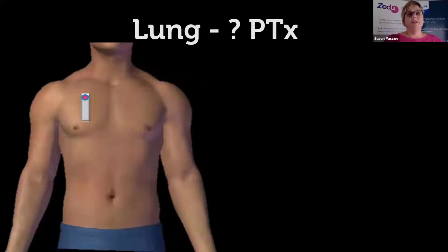If you put your probe on in transverse in a hurry, it's very easy to confuse the rib for the pleural line, because they're both bright white. So the rib has dark shadowing, the pleural line has dirty shadowing, but it's easy to make a mistake between the two. So if we keep our probe in the longitudinal, we want to just run it down the anterior part of the chest there. If there's a pneumothorax, the patient is supine, hot air rises, and that's where we should see a pneumothorax. And then repeat the same thing on the left side.